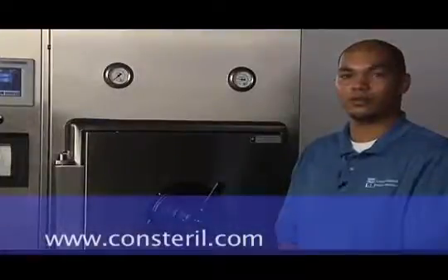Remember, following these procedures at every cycle for locking and unlocking your chamber door will help guarantee your safety and ensure proper sterilization of your goods. For more information, please visit us on the web at www.consteril.com.